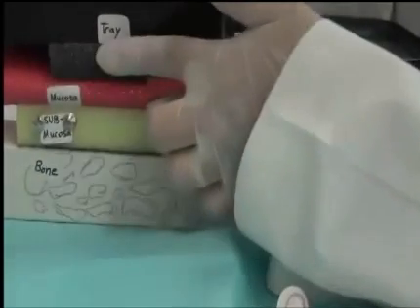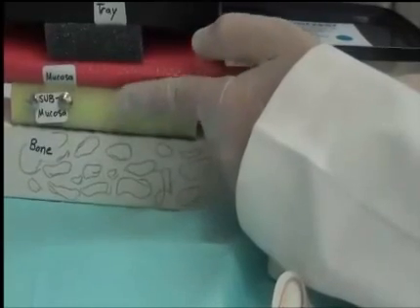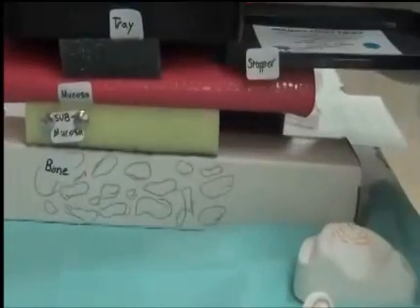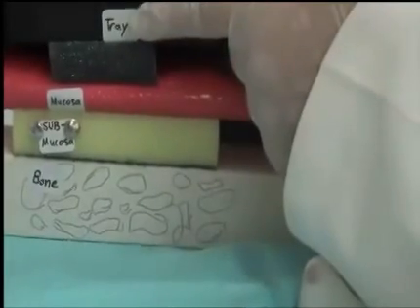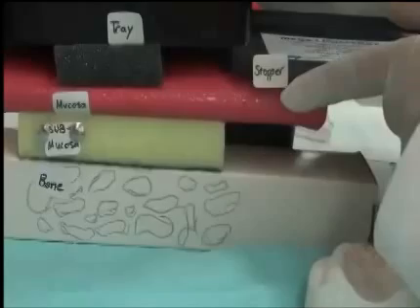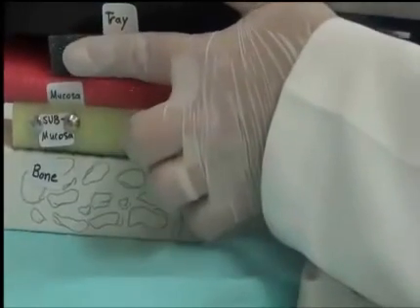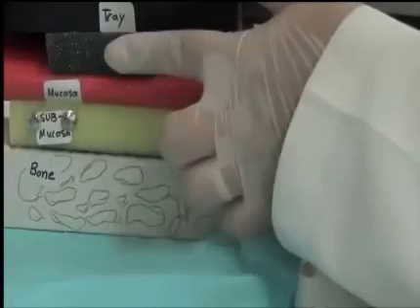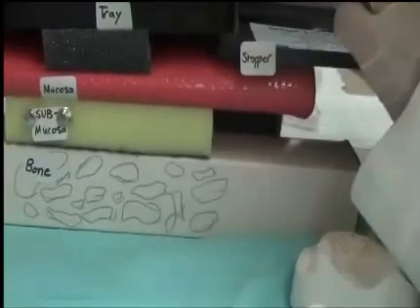So no matter how much I squeeze, the impression material stays not in a totally compressed status. This is called mucostatic. Notice that the mucosa and submucosa are not in a compressed status as they were in the tissue compressive technique. So this relief that we made with wax maintained a space for the impression material to be equal in space, not exert any pressure on the mucosa while I'm pressing on the rest of the impression.